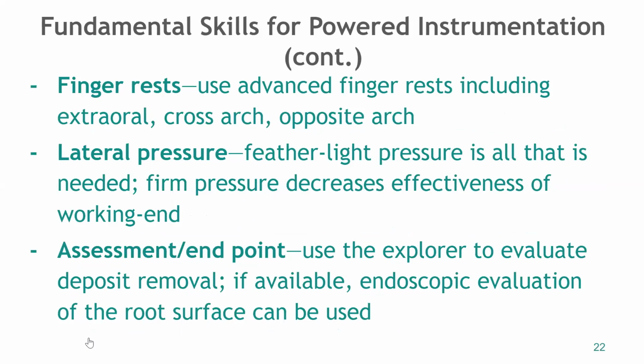And then we want to use the explorer to evaluate deposit removal. So that's super important. As always, the last thing that we do is exploration, right? Because just like I was talking about earlier, our tactile sensitivity is a lot less with powered instruments. And you'll get to where you're more comfortable with this, especially with the thinner tips where you can explore with your Cavitron tip. You can turn it off, take your foot off the foot pedal and deactivate it and kind of feel around.